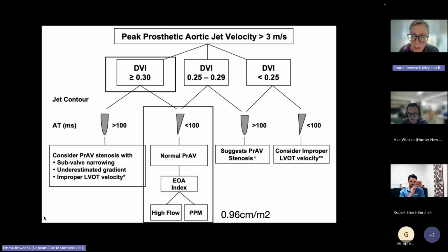He actually was very, very frail, this man. We ended up just diuresing and repeating his TTE, and his gradients did start to settle down, and we decided to keep an eye on it that way and treat his pneumonia. And as I say, his diastolic dysfunction and LAP side of things got better, and his B lines disappeared.